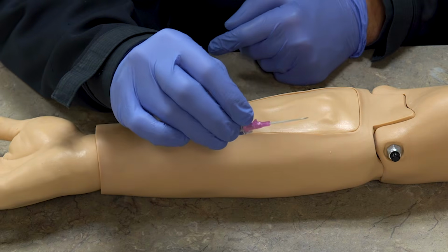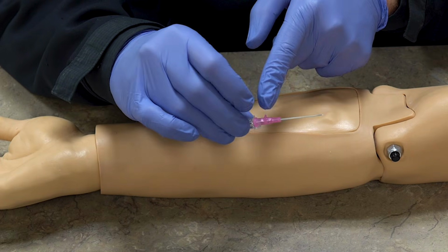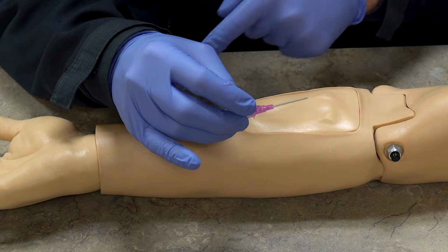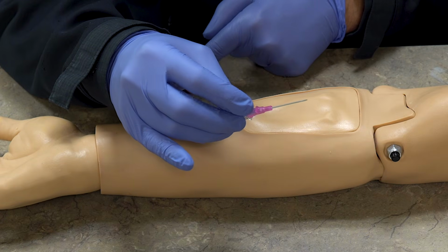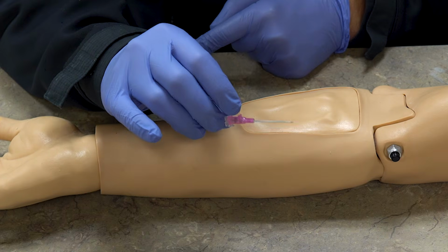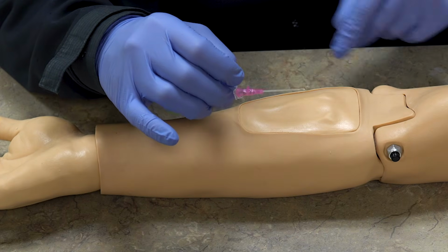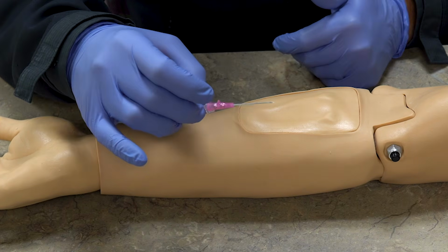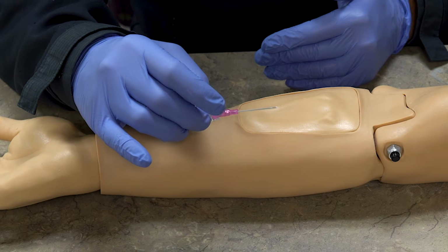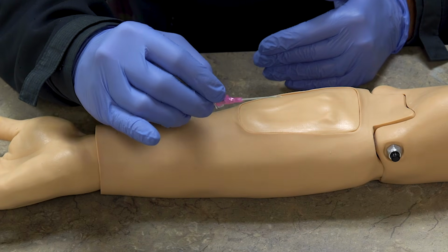Now you're gonna notice that there's a bevel on the end of that needle, and you can always tell which is the bevel side up because there's a little ridge here, and that's meant for you to push with your finger out on that catheter. So we always want bevel up, the needle pointing down, and there is a bunch of tips and tricks about what to do with the bevel. This is really basic, so I'm not gonna go into all of that. This is just the basic start.